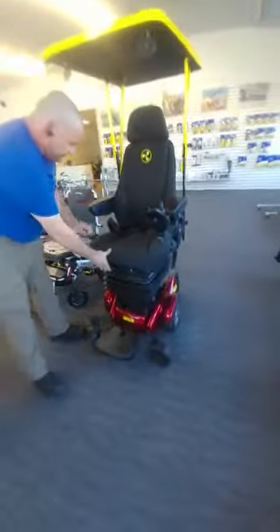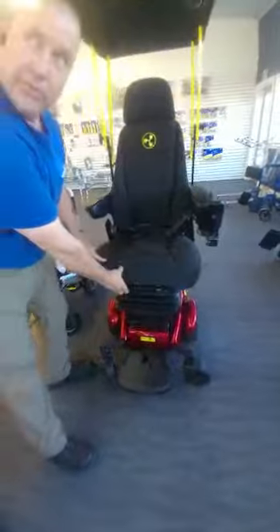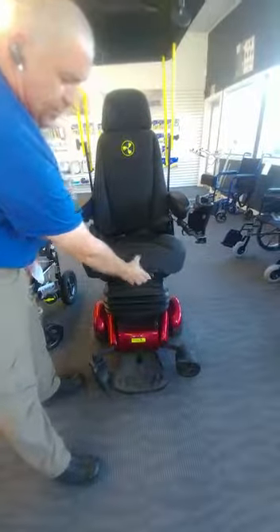The cushion also extends out for longer-legged folks. This is a rise-up support to hold you in a little tighter if you have some positioning issues.